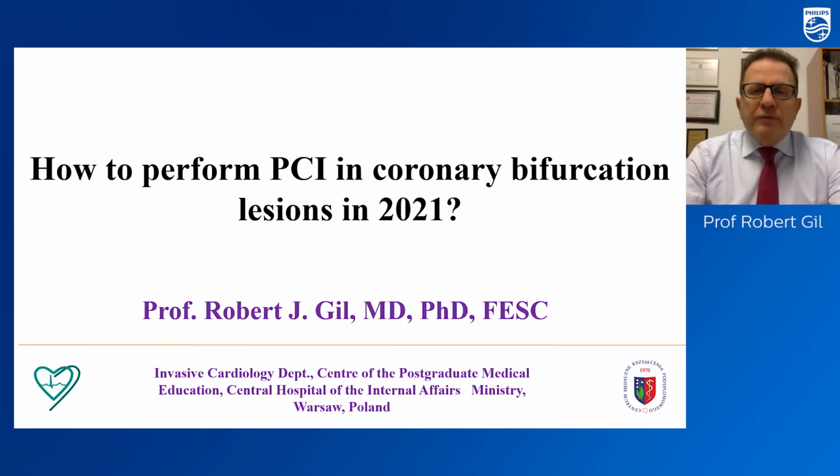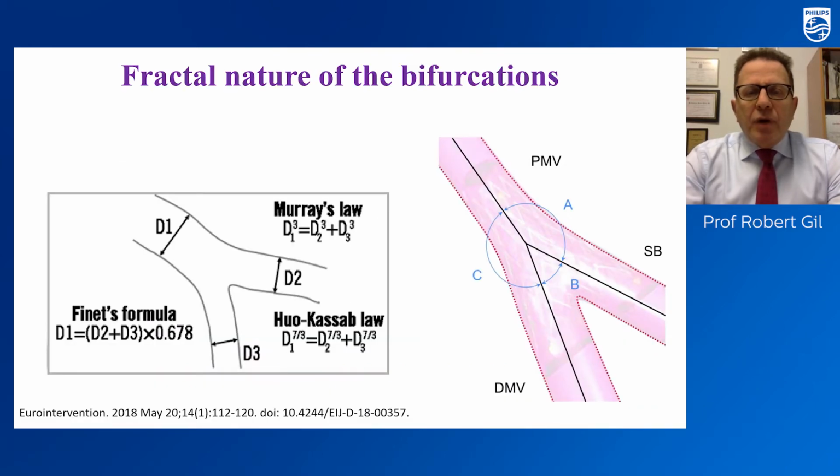Good afternoon to everybody. I hope I will be able to present you my philosophy regarding coronary bifurcation treatment. We all know as interventional cardiologists that performing procedures is the most exciting and best part of our work.